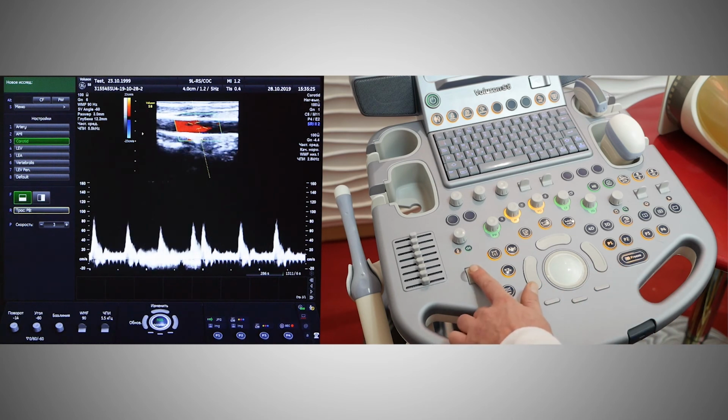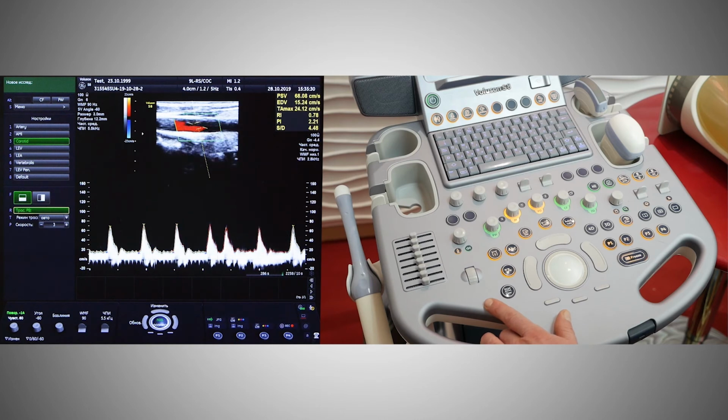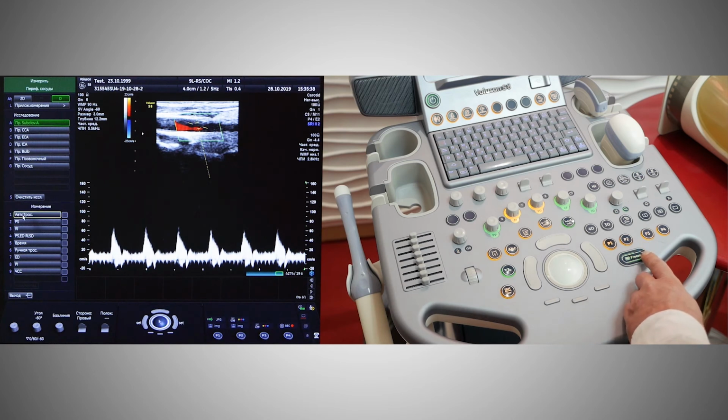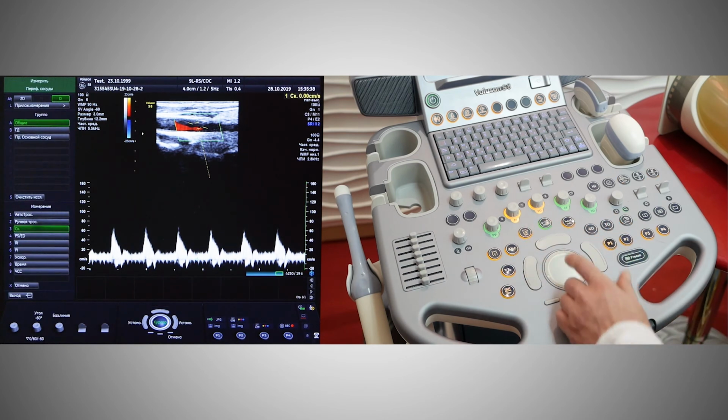On the left side of the screen, we see tracing. It means the device takes measurements on its own. That's measurements which are carried out in a pulse wave Doppler. When caliper is turned on, we get simple measurements.